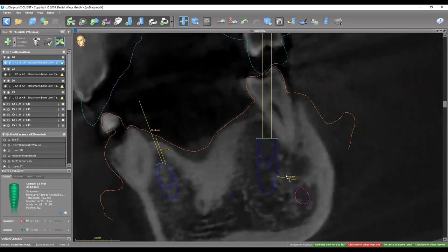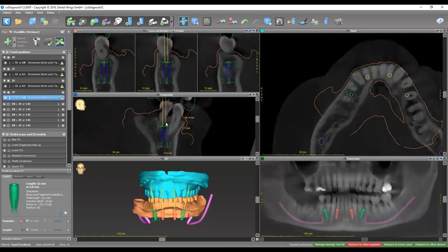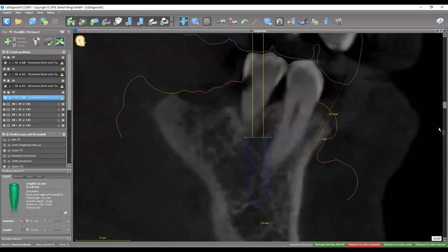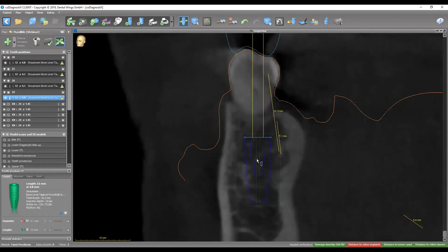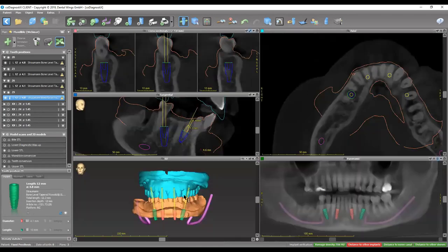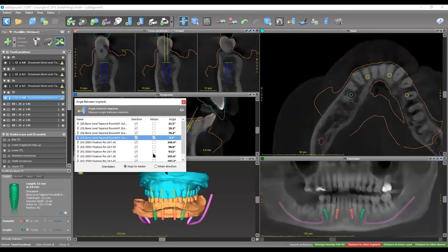We have enough room to push the implant more distal if needed for better AP spread. I'm going to show you in a minute how to calculate the AP spread. The other distal implant is also a 4.8 by 12. The bone is really wide — more than three to four millimeters from the lingual and buccal plates, and the center of the implant emerges from the central fossa towards the functional cusp of the opposing molar. Using the angle calculation tool, the difference between the two distal implants and the anterior implants is around 30 degrees exactly.